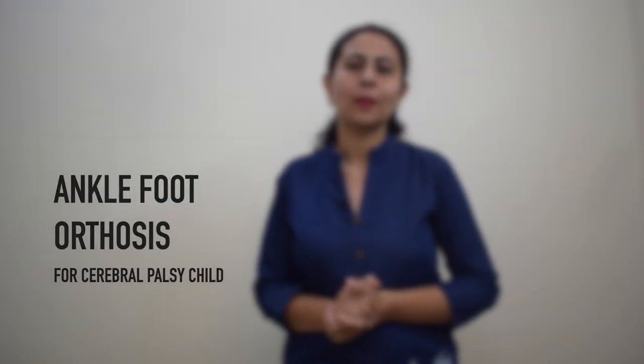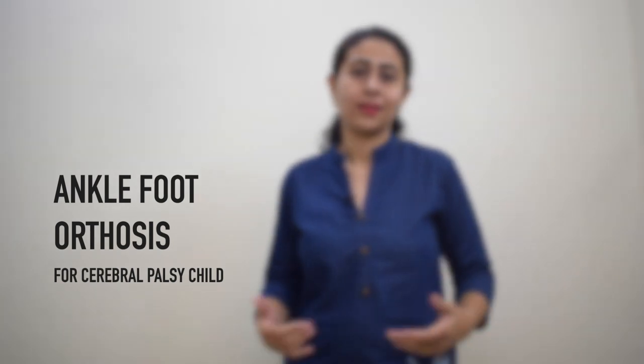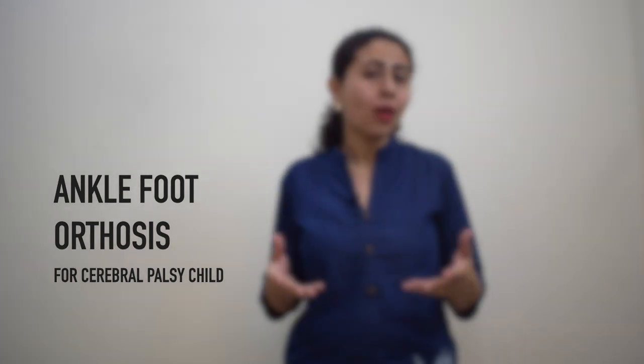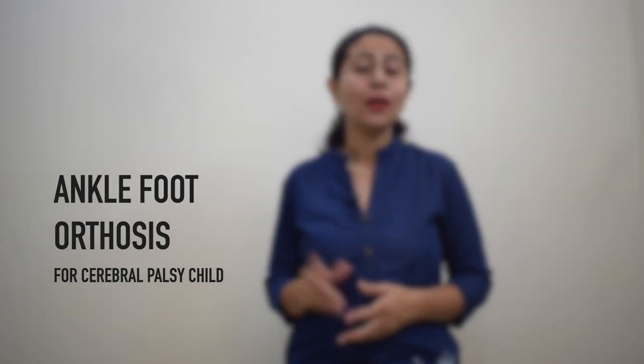In today's video, I'm going to talk about something called ankle foot orthosis. Ankle foot orthosis is nothing but a brace or an orthotic device which has to be worn on the legs for a CP child.